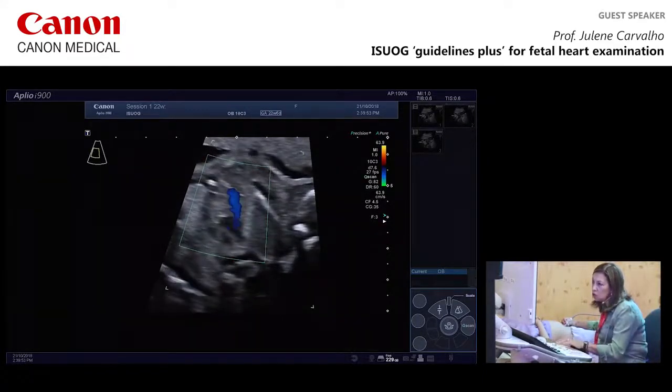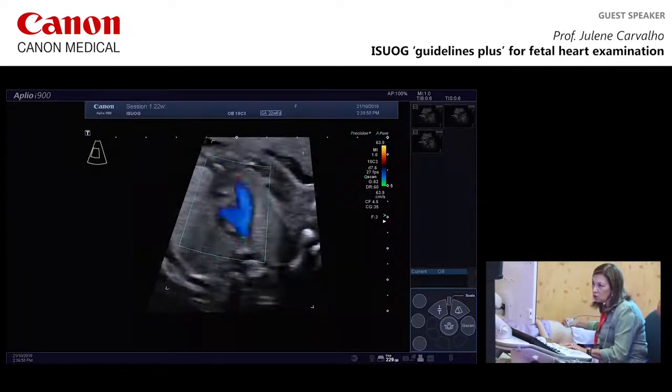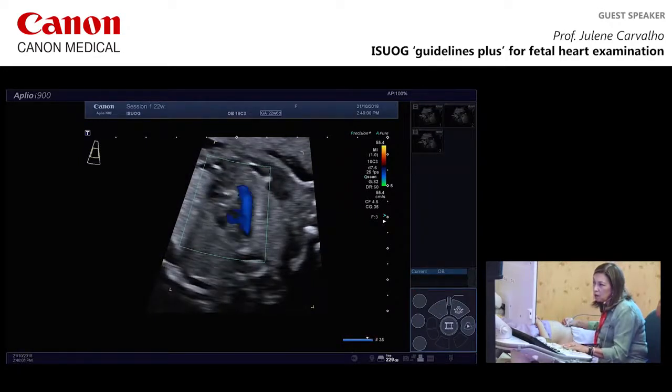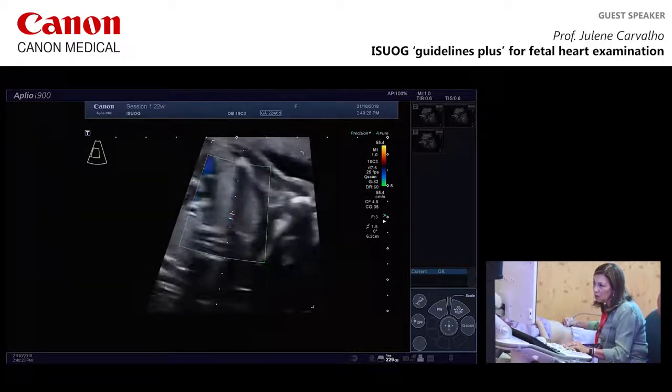But just look at the image in the pulmonary artery. I'm going to lower the velocity a little bit to exaggerate it. You get a bit of green around here because I lowered the velocity, from 60 to 70, I put it to 55. So we know that velocity is around 60, but here you're getting much more aliasing because we are in the duct. In the duct, the velocity is much higher than across the pulmonary valve. It's the highest velocity in the system.